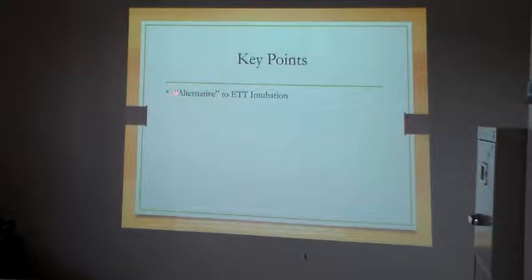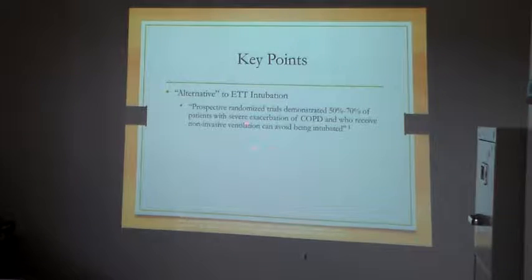So, this is an alternative to endotracheal tube intubation. Okay? We want to keep them off the vent, and this is why. Randomized trials have demonstrated that 70% of patients with severe exacerbation of COPD, so again, asthma, CHF, emphysema, bronchitis, bronchiolitis, and pneumonia, that receive non-invasive ventilation avoid being intubated. We want to keep that tube out their throat. 50 to 70% end up not being intubated.